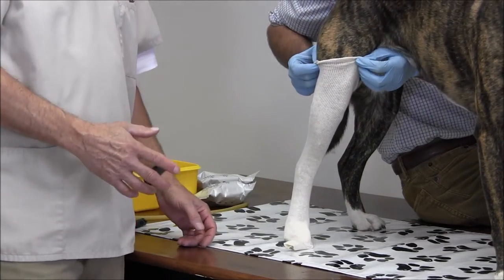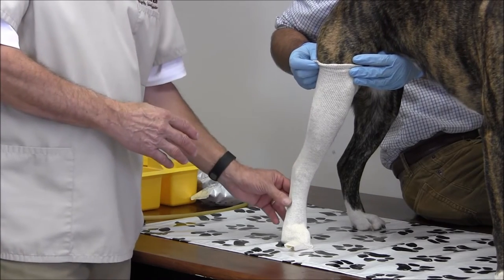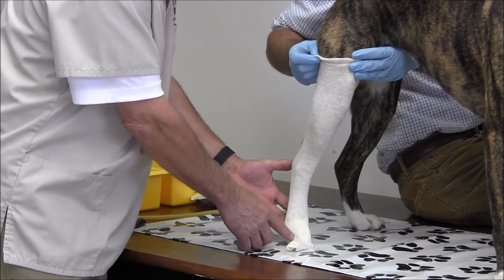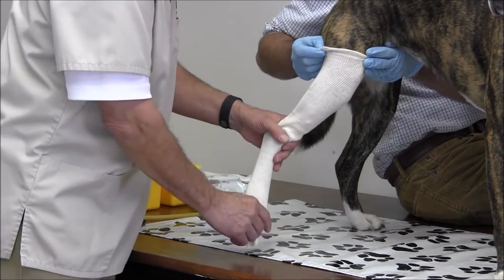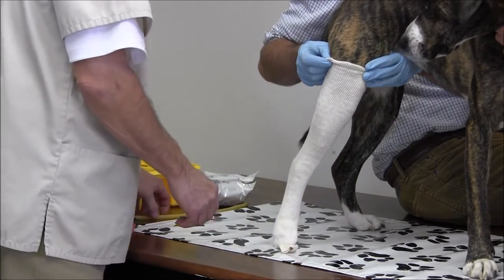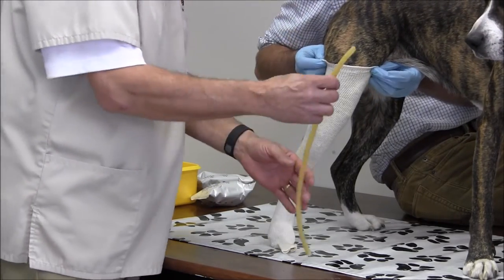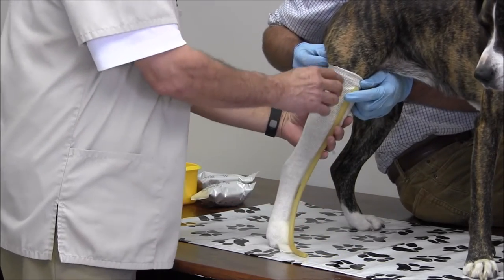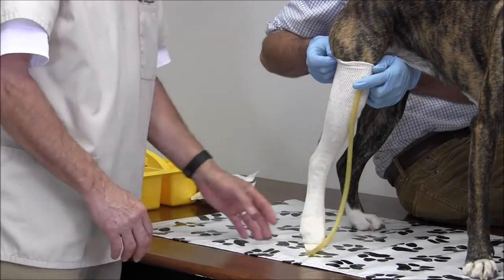When we take a cast of a hock paw brace, we want to make sure that we cast it in the position we would like the brace to be in. We also want to make sure that the paw is at a standing angle — it should be close to 90 degrees. We don't want the paw pointed downward unless there's a contracture. Then we'll use a surgical tubing or some cutoff strip going cranially, or towards the front, with the tubing extending down beyond the paw.